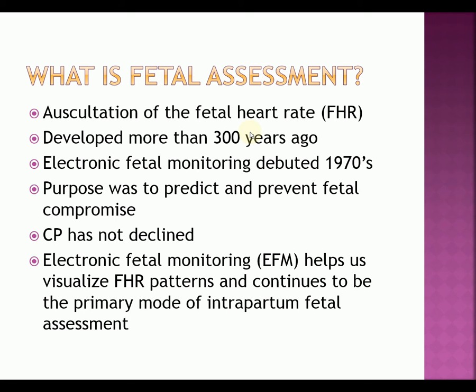So what is fetal assessment all about? Well, it's an auscultation of the fetal heart rate. More than 300 years ago, when none of us were alive, we developed methods of listening to the fetal heart rate through devices, and some are still in use today, such as the fetoscope, where you put a portion of it on your forehead and then put the stethoscope portion on the belly to listen to the fetal heart rate.